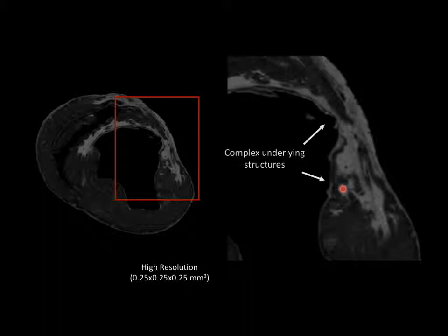I tried for 5 years to do this. One of the best state-of-the-art imaging equipment that we had just received at high field strength, with the most advanced motion correction and selected gating stuff. And the problem is, at 250 microns, the heart just does not come back to the same place, beat to beat. So your resolution is essentially governed by the fact that those heartbeats are not coming back to the same spot.